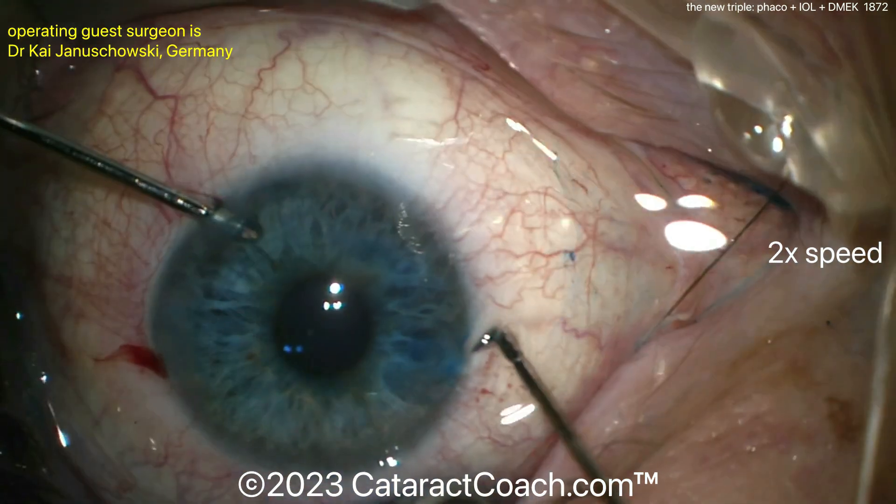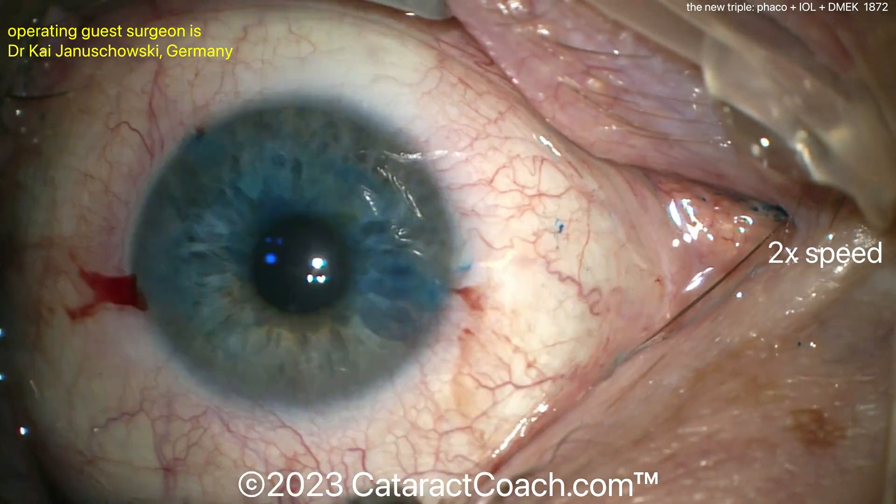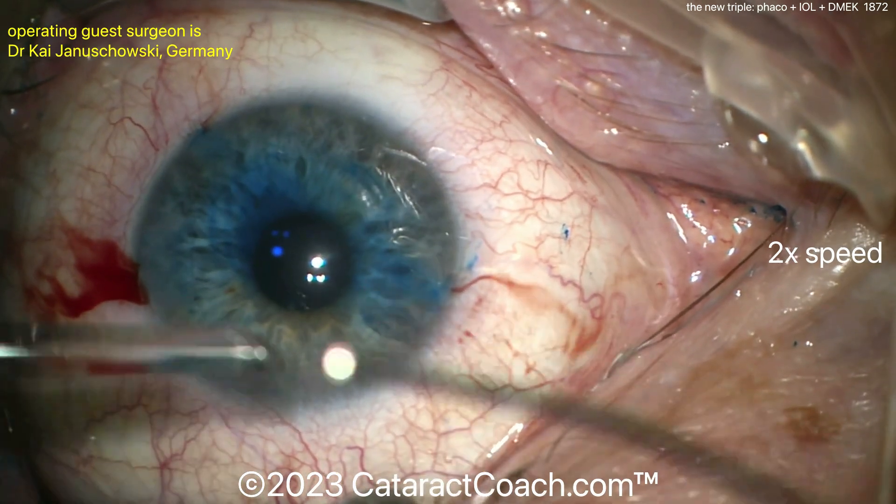Now a little tri-pan blue dye will go in to make things a little easier to see, and it'll be washed out to dilute it down. The graft, I'm assuming, is already pre-prepared because, again, this is very efficient surgery — in real time this was under 10 minutes. Surgeons who do this a lot can be very, very good at it.